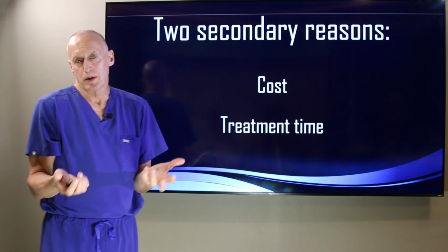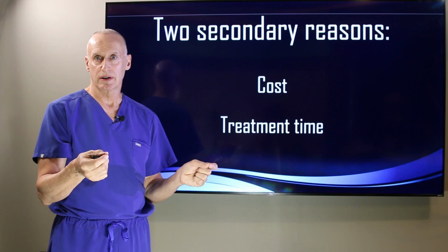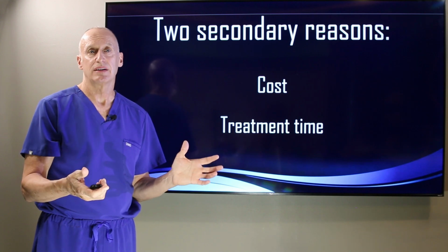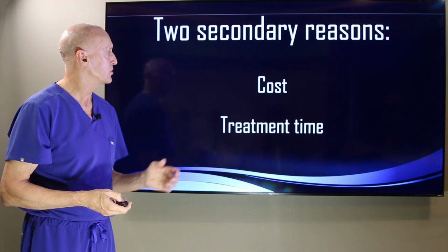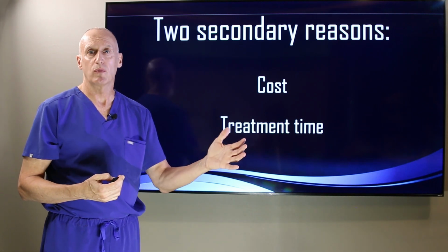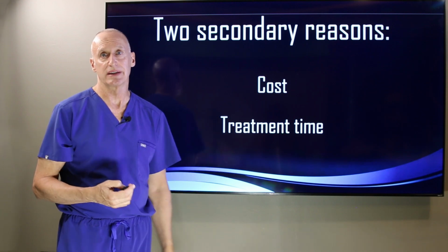And the treatment time. Our average treatment time from start to finish is 5 months if you have good bone and gums. If you need bone grafting or there's any complications along the way, it may take us 8. Sometimes with lots of bone grafting, it might even take 11. So those are the 3 primary reasons that implant bridges, or FP1, are incredibly rare. Far less than 1% of the reconstructive implant cases being done.